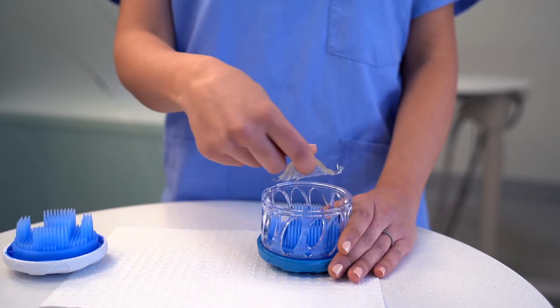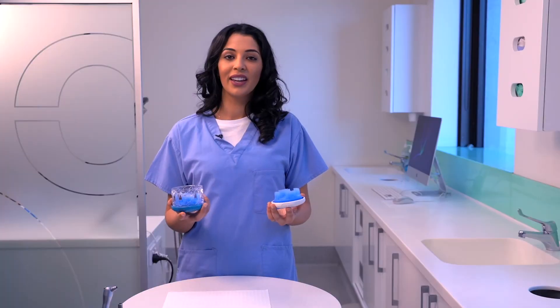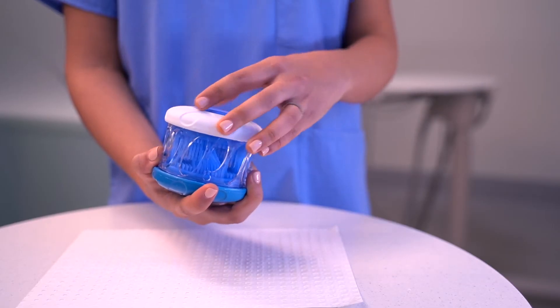Now nestle your retainer into the bottom brush of the device. To close your Dr. Mark's Hygiene, simply place the white top handle onto the perforated body and turn until it clicks into place.